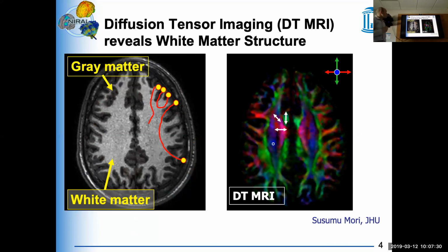Now, this is a diffusion tensor MRI image, and it is colored with the local orientation of the diffusion, which goes along with the local orientation of the fiber. So green would be something that goes front, back. Blue, something that comes out, so top, bottom, inferior, superior, and red would be left, right. And you can see from this already what's the local orientation of the fibers, and we could probably reconstruct what the tracks look like, and we're going to get to that later.